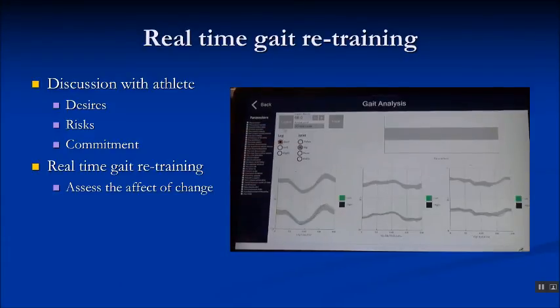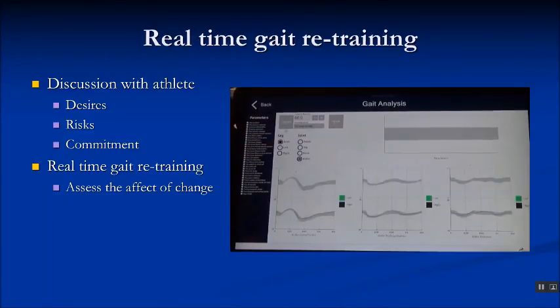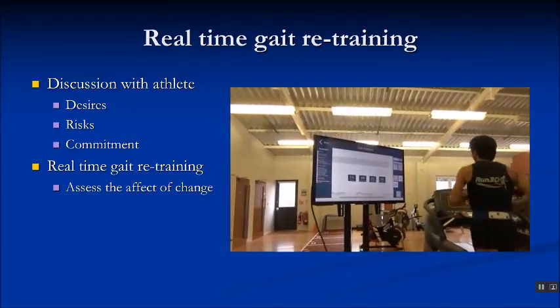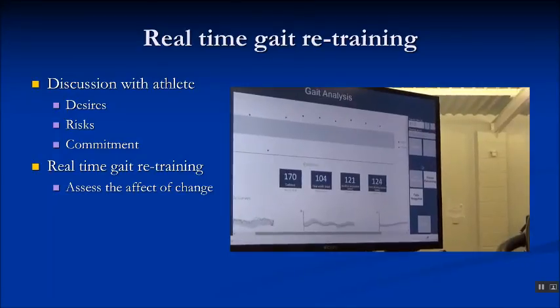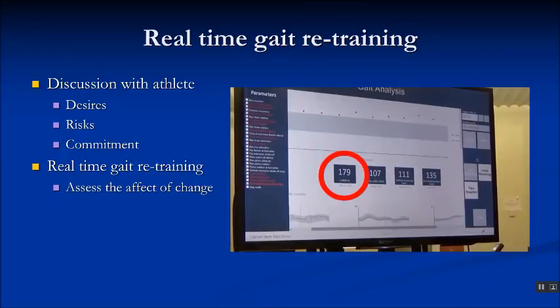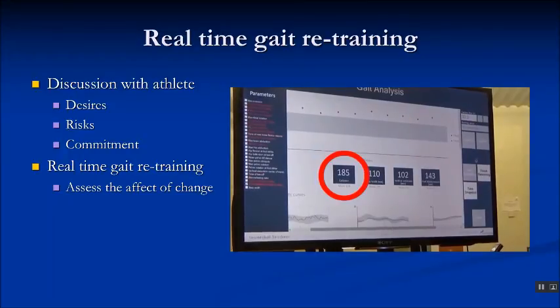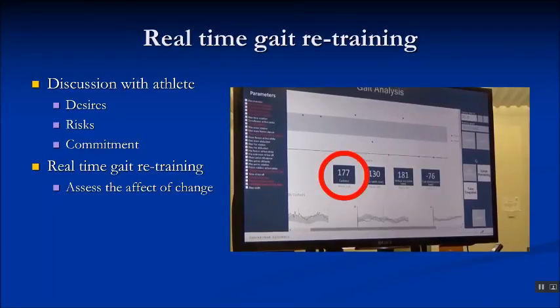This gives us the option for real-time gait retraining. You'll see how we can choose which area we look at and examine the various parameters, which helps us not only to change function but to see where we may place load when we change that function. In this example we're simply changing the cadence and step rate to look at how that affects whichever aspect of the lower limb we choose — whether hip adduction, hip extension, step length, etc.